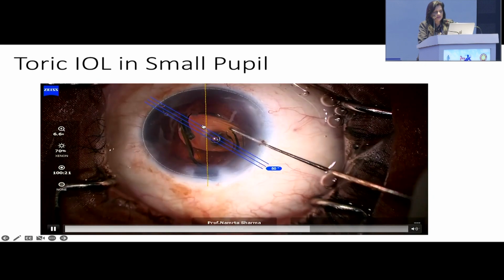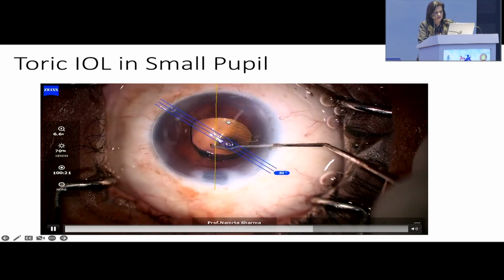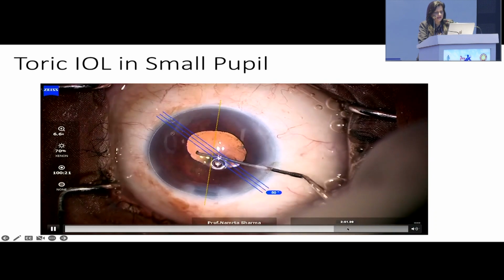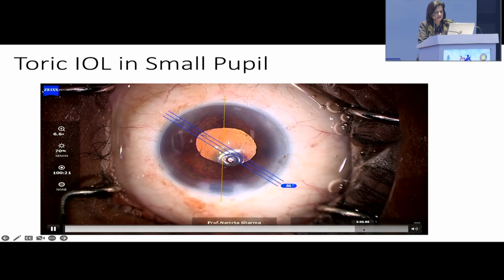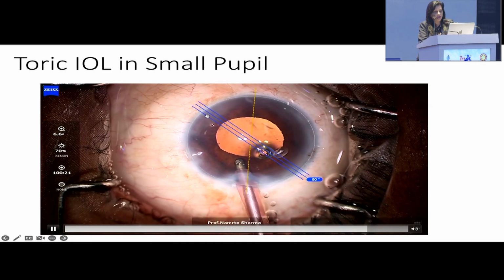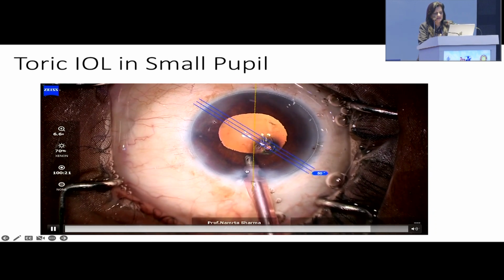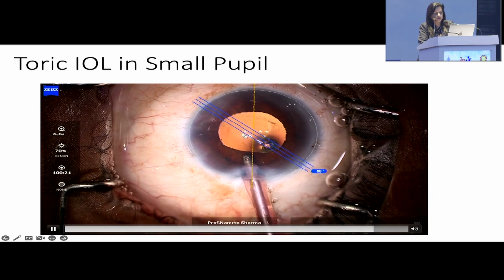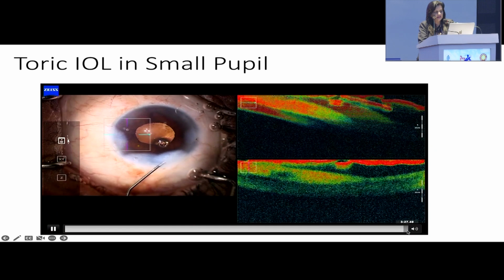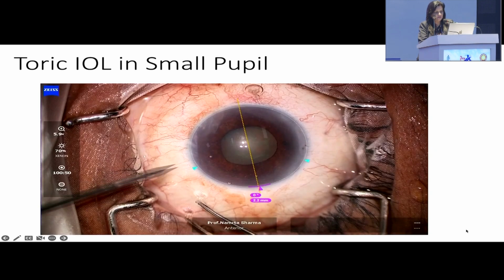implantation. But as you implant the lens, you can also see at what axis it is going. And then, at least from one edge, one can always use a Sinskey hook to see at what level these markings are. Here you can see as the irrigation aspiration is being used, the pupil slightly dilates, and then you know that it is the correct axis.